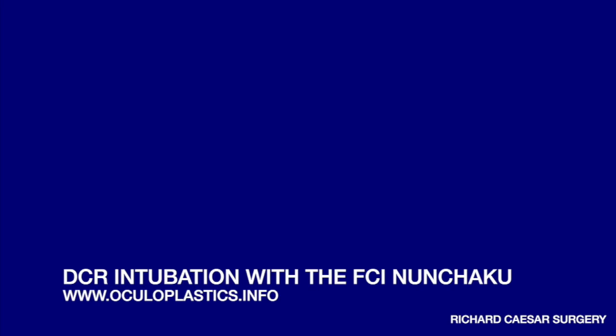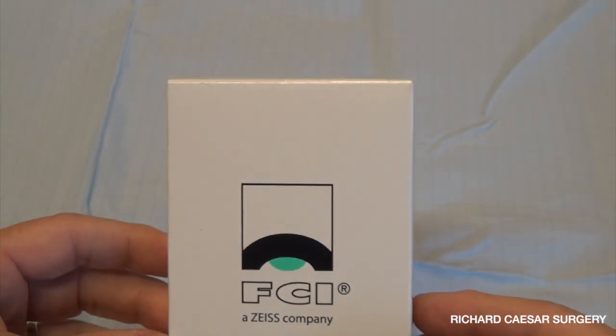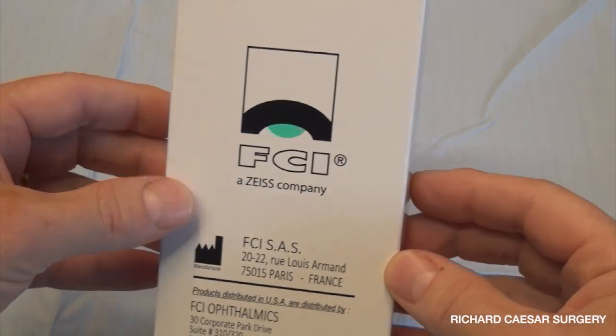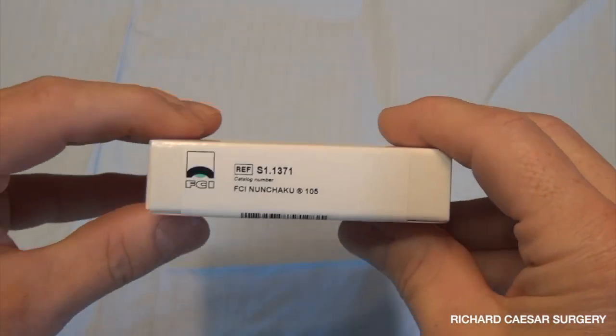Hi, this is Rick Caesar here. Today I'm demonstrating bicanalicular DCR intubation using the FCI Nunchaku.